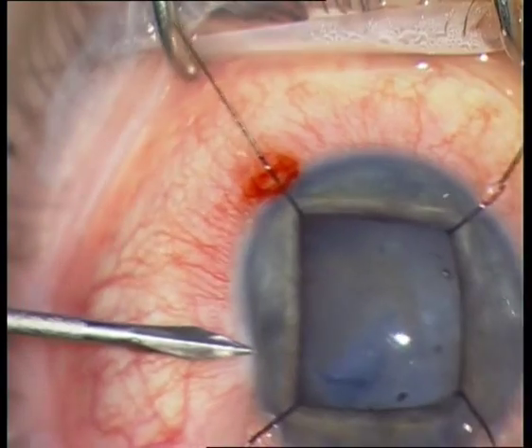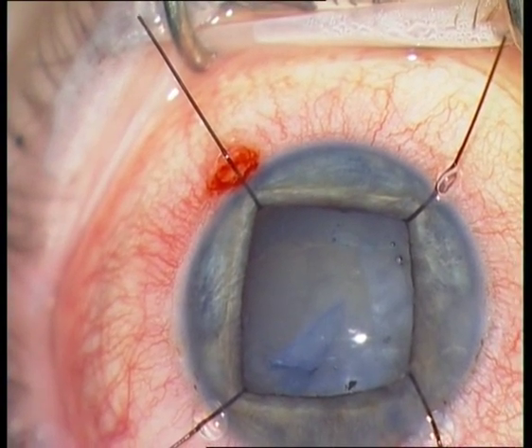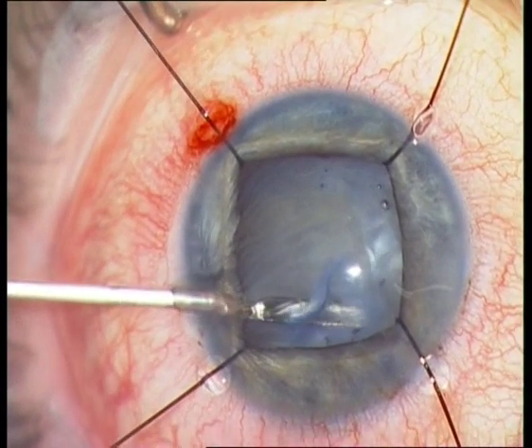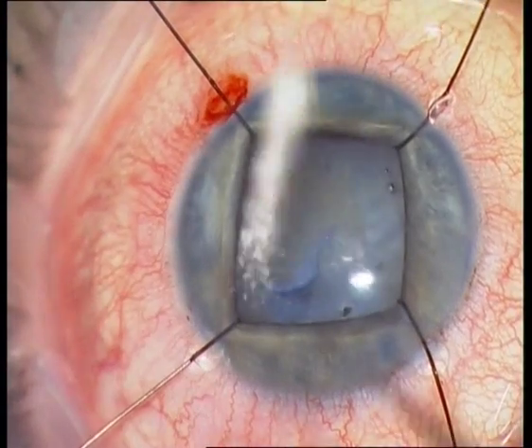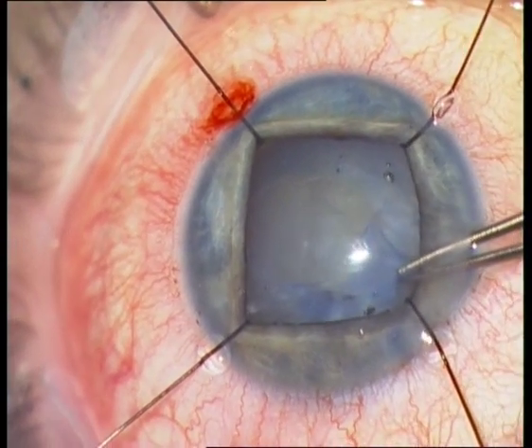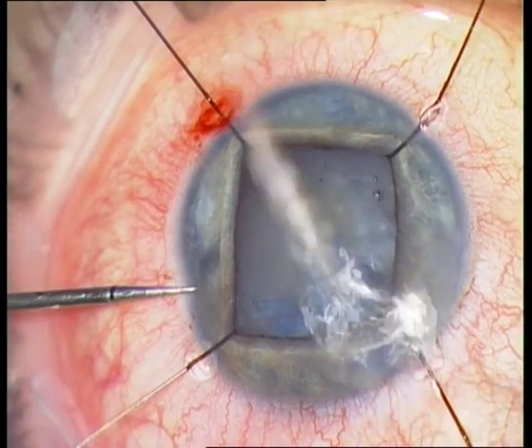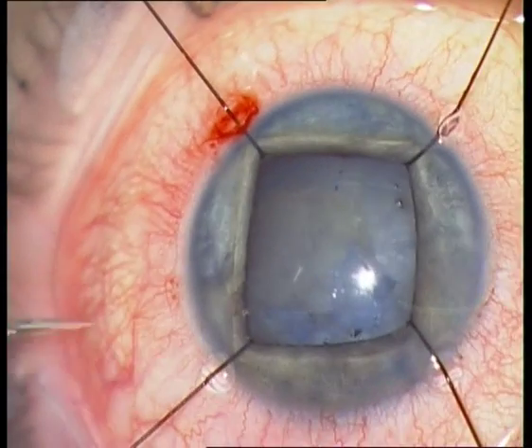So again a new side incision in order to enlarge the rhexis. You can see all the folds in the rhexis. And again a new side incision — I need the scissors to continue the rhexis because the anterior capsule is too thick.